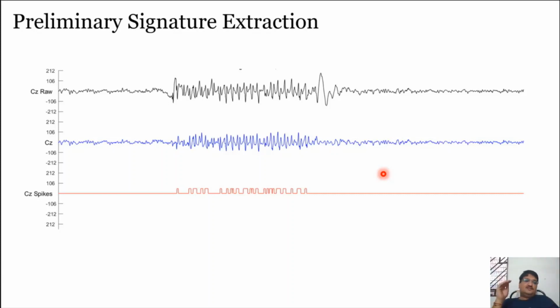electrodes are placed on the affected side. So coming back to the epilepsy classification, like I have done for spikes, you can do it for sharps and waves, and not only for one channel but for multiple channels, and finally you can give some impression that this channel is having some activity. One point here I would like to mention is that some epilepsies will have specific combinations of patterns as a signature.